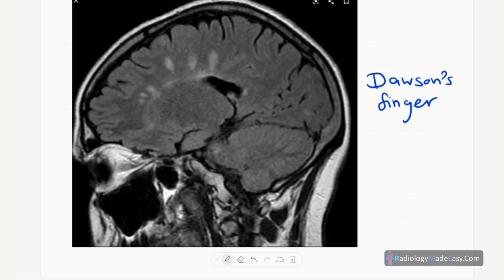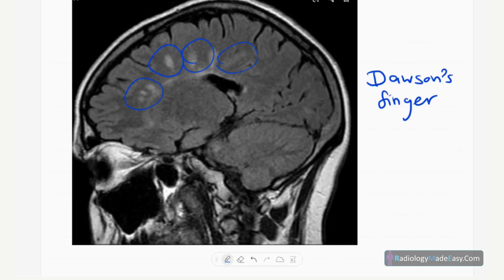Here you can see a sagittal section FLAIR image of MRI brain. You can see finger-like lesions involving the corpus callosum and periventricular deep white matter — we call these Dawson's fingers. These are FLAIR hyperintense lesions.